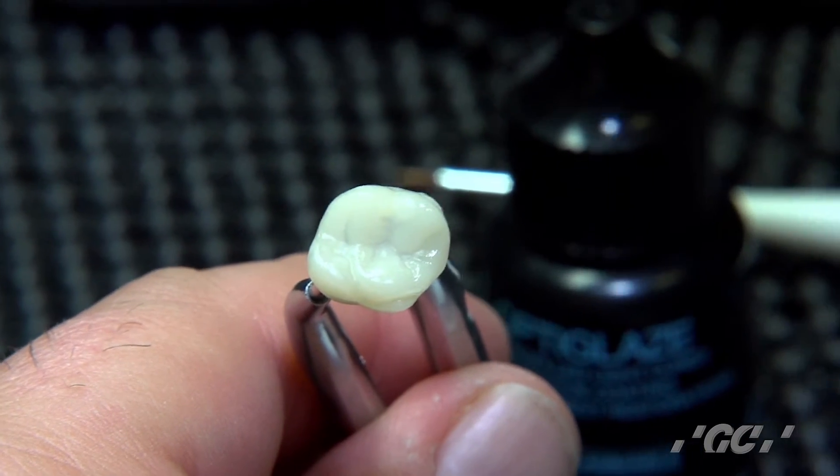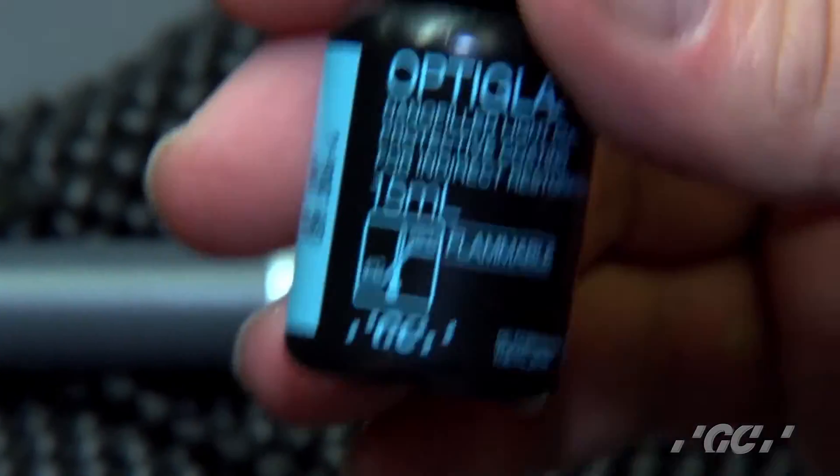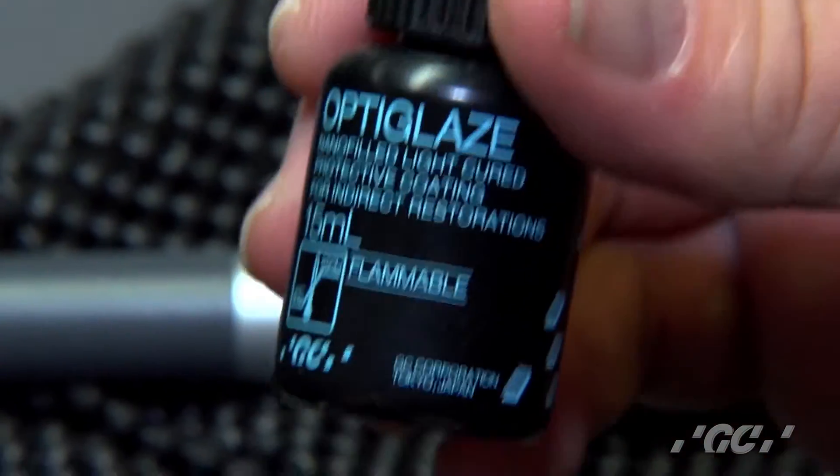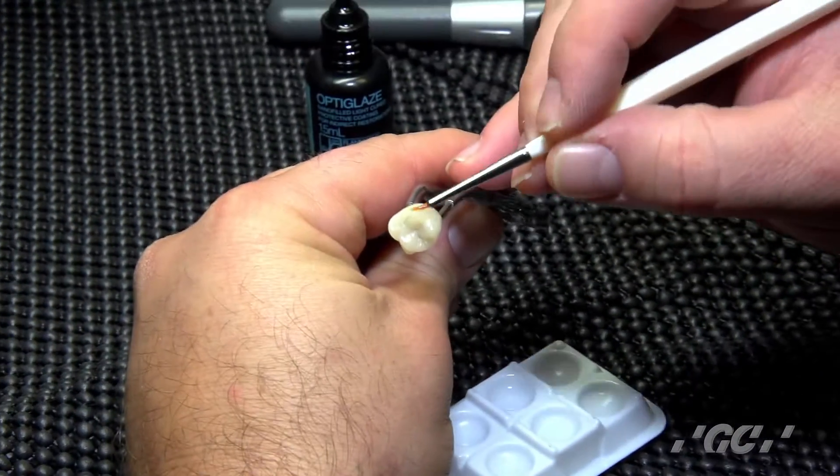After the Ceramic Primer 2 dries, we'll show you how quick and easy it is to use the OptiGlaze itself to get a nice glaze over the surface of the Cerismart restoration. Literally just coat the entire surface with the glaze.